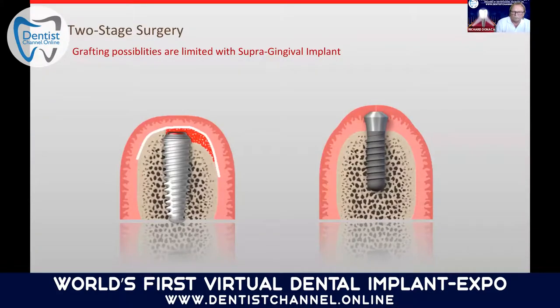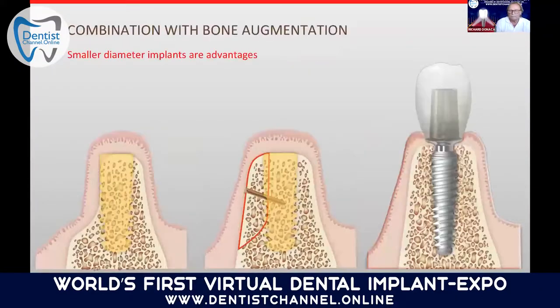There are also some advantages to subcrestal implant placement in that you can do augmentations. It's very easy to work with smaller implants. You have more bone support. So it's a very good possibility to take subcrestal implants and do bone augmentations in one seating. Bone grafts are also easier with smaller implants that take strong loads, because you can do a simultaneous bone graft and implant placement.